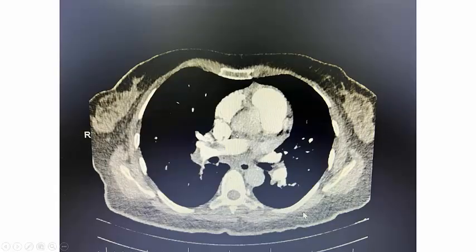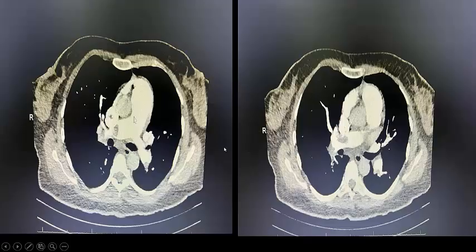CT pulmonary angiography confirmed the presence of pulmonary emboli at the level of the main branches of the pulmonary arteries. There is a filling defect in the right pulmonary artery branch, another filling defect in an additional branch, and filling defects in the left side as well.